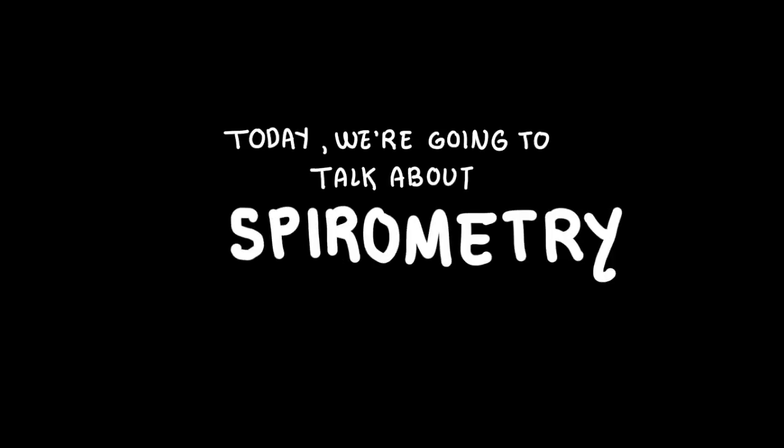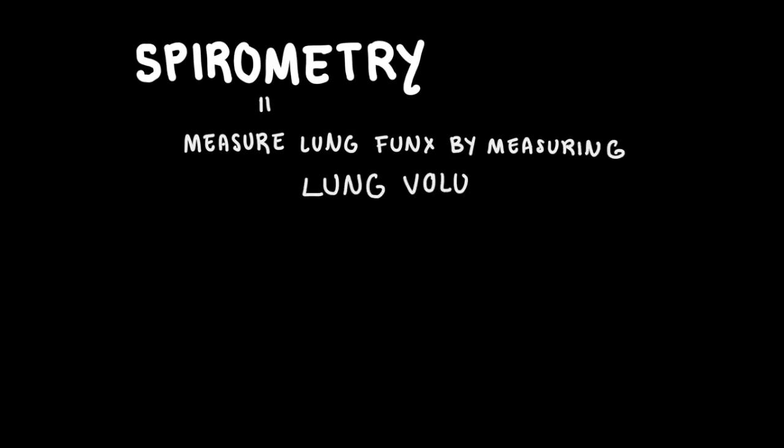Today we're going to talk about spirometry. What is spirometry, you might ask? Well, spirometry measures lung functionality by measuring lung volumes, or the amount and speed of air that can be inhaled and exhaled by a patient. It is the most common pulmonary function test used today.